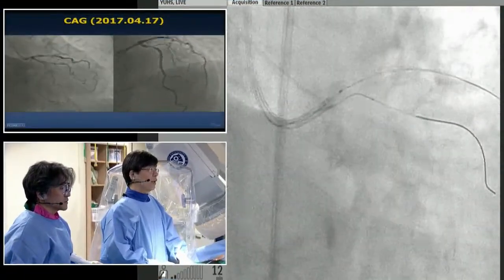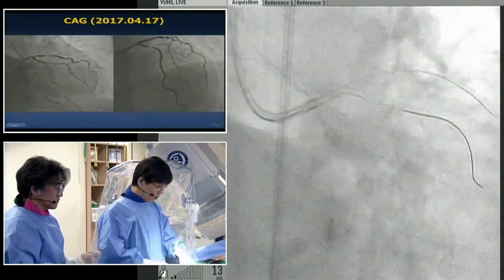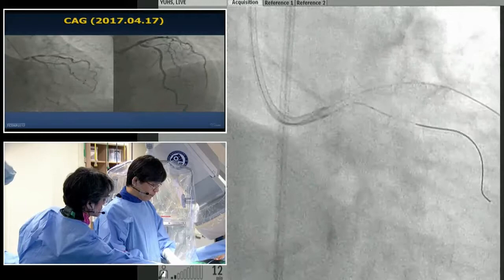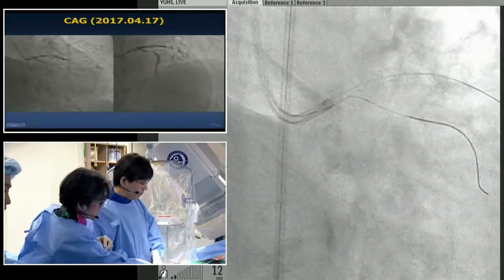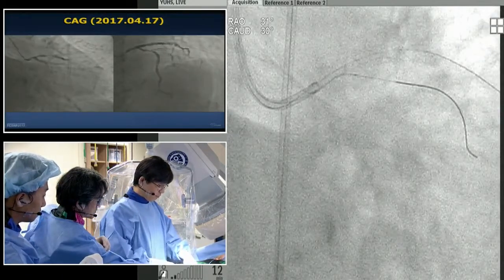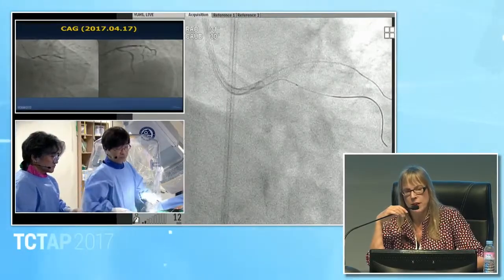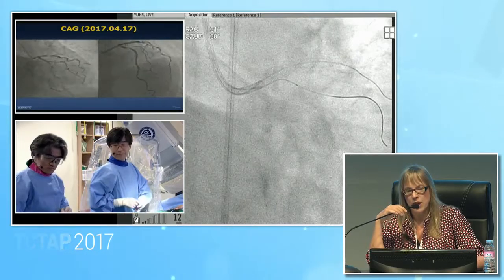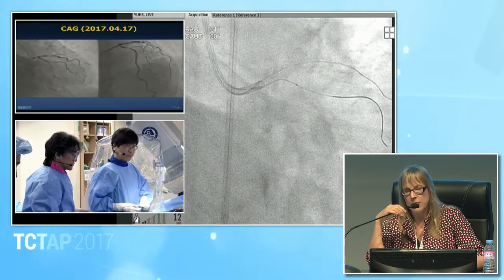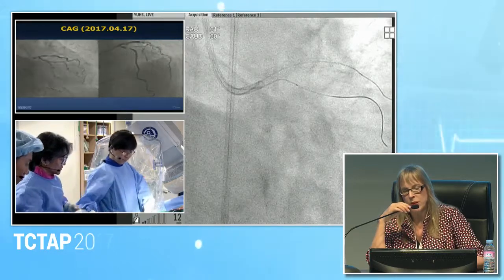Okay, let us check the ostium of the left main with IVUS again. This will be interesting now because you performed post-dilatation proximally, at the bifurcation with the circumflex. What we typically see is that by these post-dilatations we change the geometry of the carina. It will be interesting to see how the ostium of the circumflex looks right now. Probably it will be more elliptical shaped.